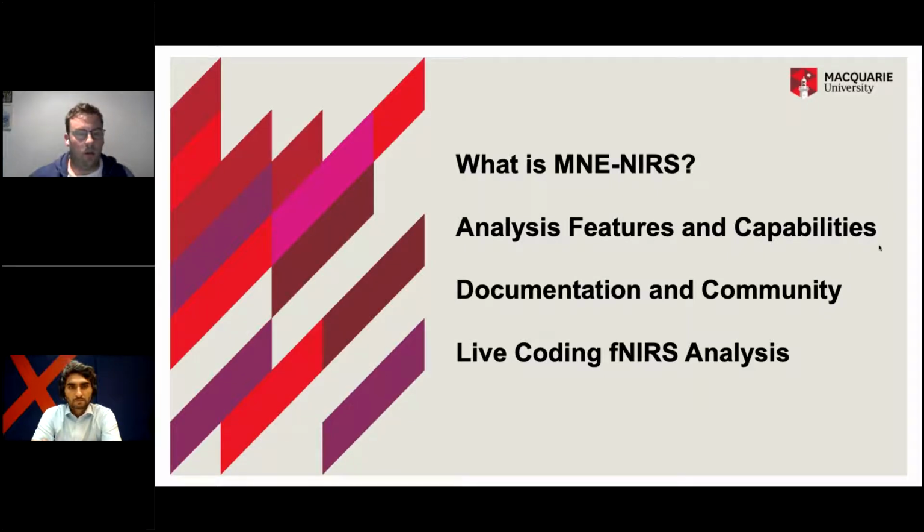And then I'll show you how to get help and how to learn things, so where all the documentation is and about the MNE community. And then we'll go through a live coding example with the toolbox.